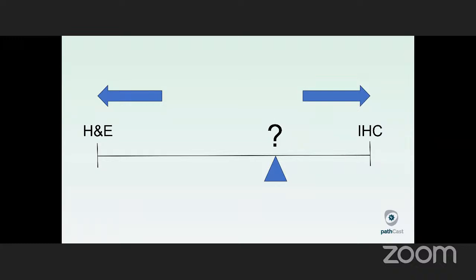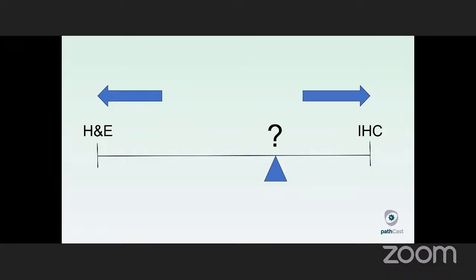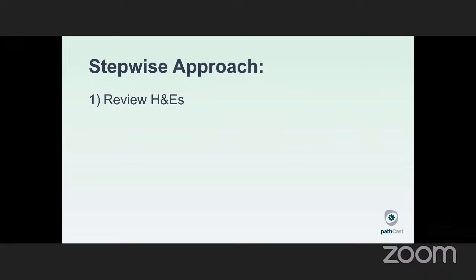And if you think about very old school pathology where it's just straight H&E, we're not doing that, obviously. But there's also the other side of it where you just say, well, look, I'm not even going to use much. It's a blue cell tumor. I'm just going to throw a whole bunch of immunostains at it. And so it's kind of like a slider bar, and you think, where on this slider bar should I be? How much should I go with H&E? How much should I go with a bunch of immunostains? And I think it really is entity dependent. But the approach today, I think, will give you a better idea of where to be on that slider bar.